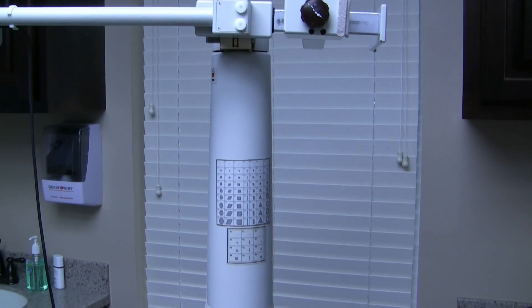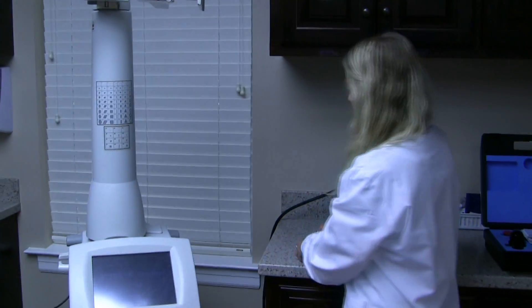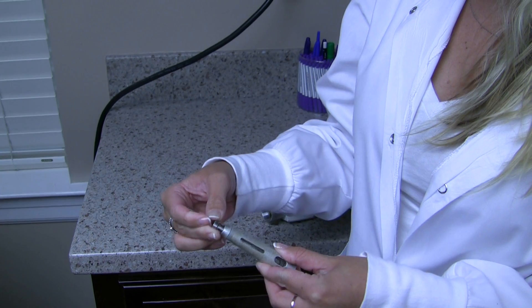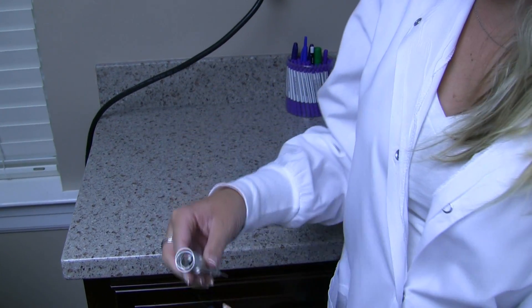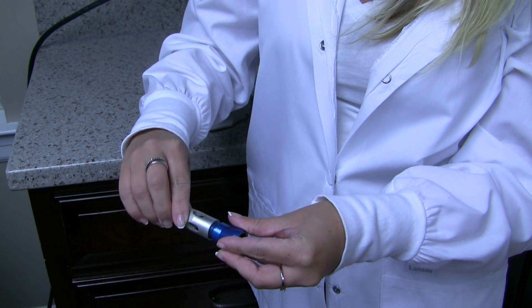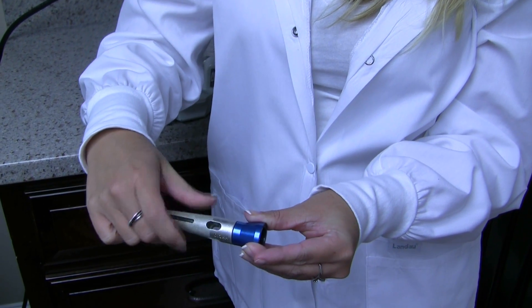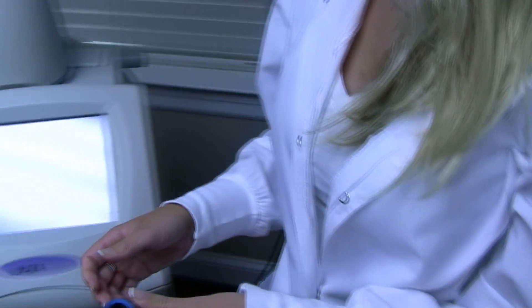We are going to take the cutting wand handpiece and come a little closer for Alyssa. She is holding it right here — the two pieces she is showing you just slip in and you heard it click. The blue is the laser connector, so it lets the machine know which handpiece we are using, and it just screws on. The blue piece does not get autoclaved, gassed, or anything due to the lens on the inside.